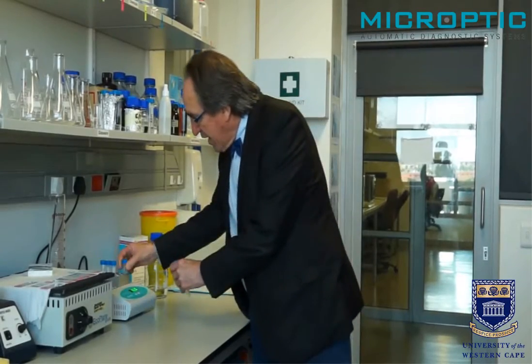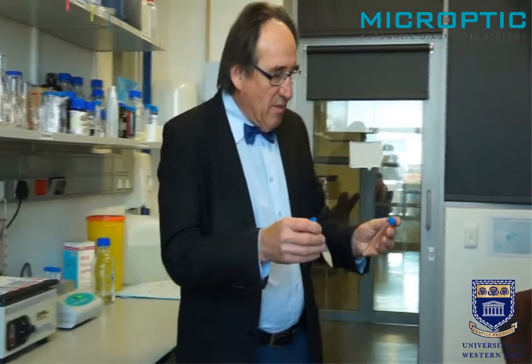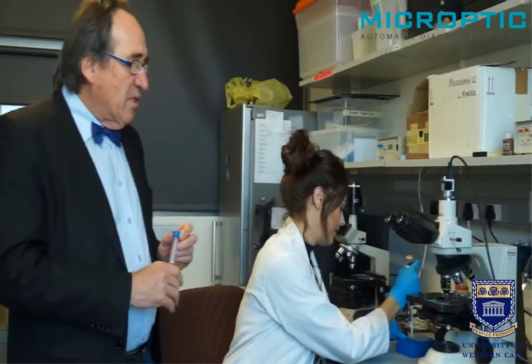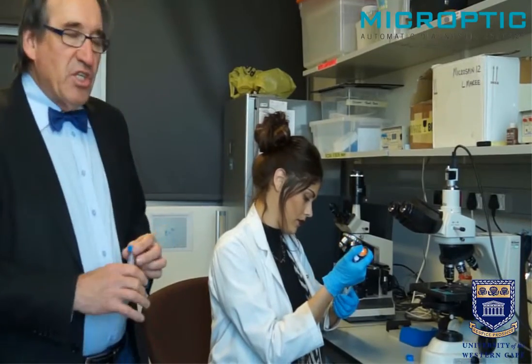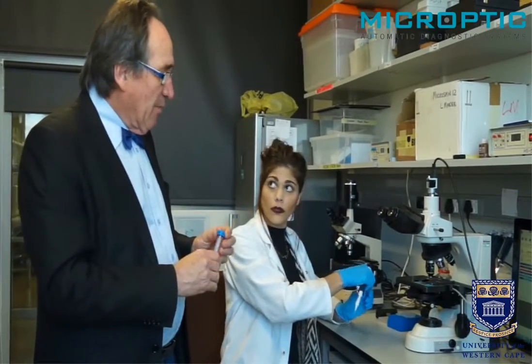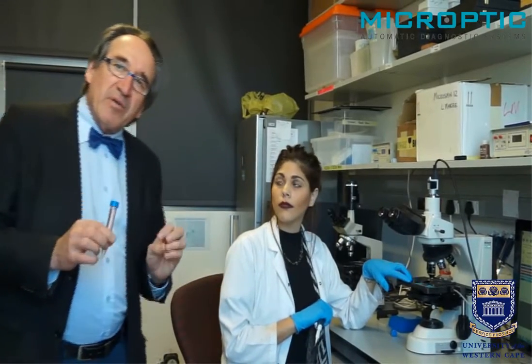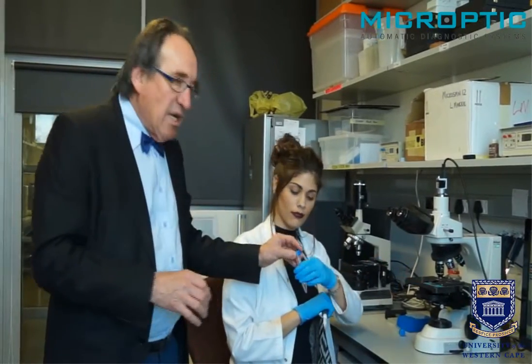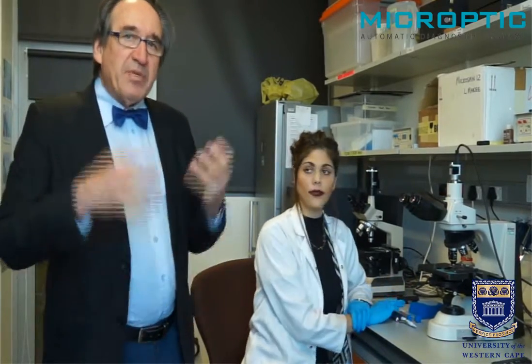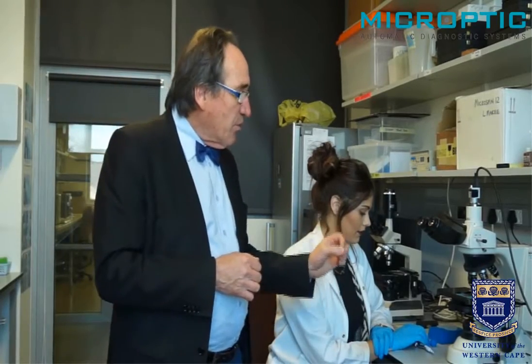And what we're going to do now — I'm going to hand the samples over to Shannon Kaiser. She's going to inject part of the semen sample into the Leia chamber, and then chase it, or flush it, with a capacitating medium. I just need to explain what we're doing here. It is a new technique, really — the flush technique. Swim-up techniques into the medium take a long time, and sperm can capacitate or become hyperactivated in one, two, or three hours. It is clinically not a friendly test that way.